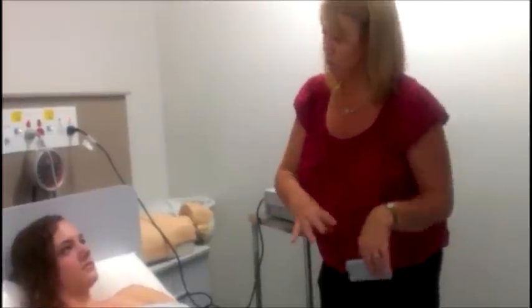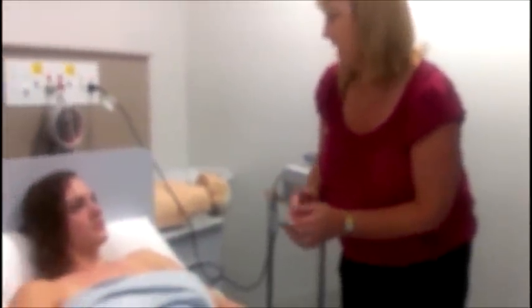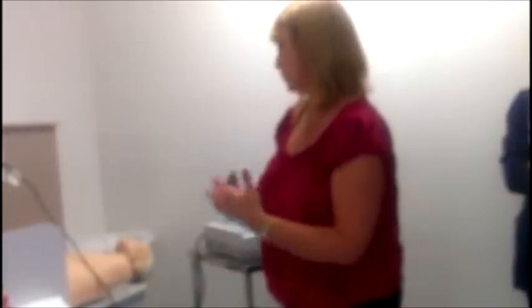It does take a little while to set up, but the actual procedure itself only takes less than a minute. It's not going to hurt you at all, except for my cold hands and the cold stickiness. When I'm set up I'll tell you I'm ready, and I just want you to relax and just breathe normally. We won't talk at that time, so I just need you to be still. Up until then you can talk, or if you've got any questions you can ask.